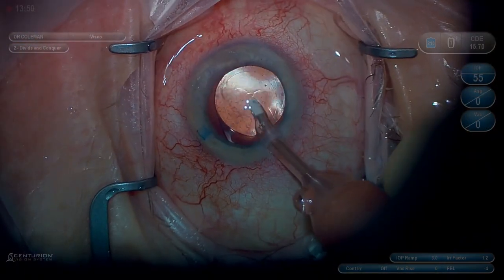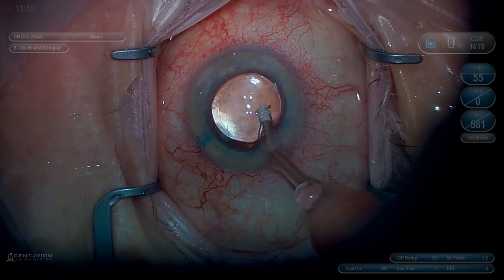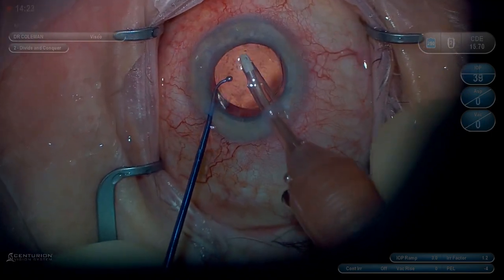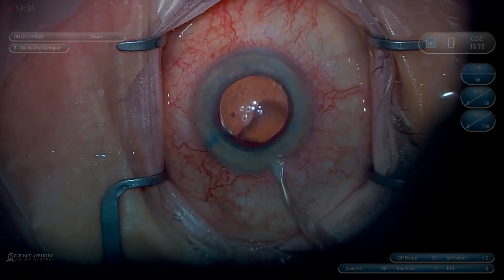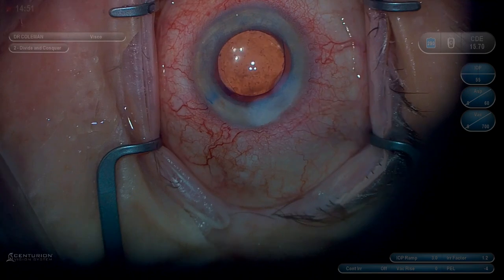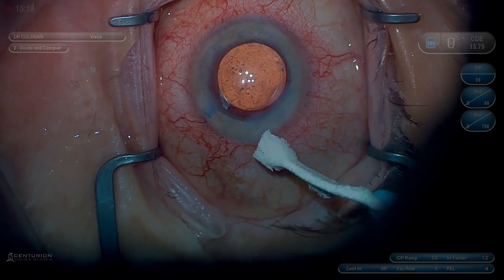Remove the viscoelastic. I always go behind the lens by sliding it over slightly. You can see even this little tiny fragment of a very thin dense nucleus doesn't come out well with the I/A, so you have to be careful to get as much of it as you can prior to I/A. Hydrate and check wounds. Beautiful case — the patient did very well.